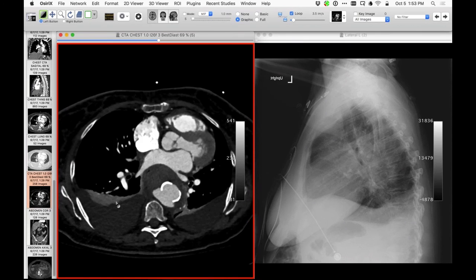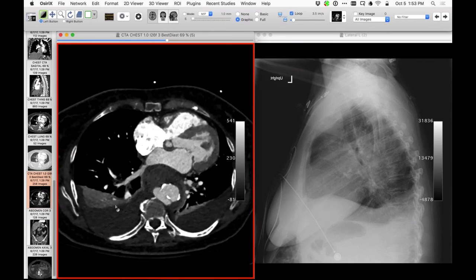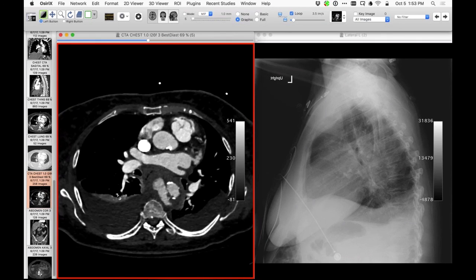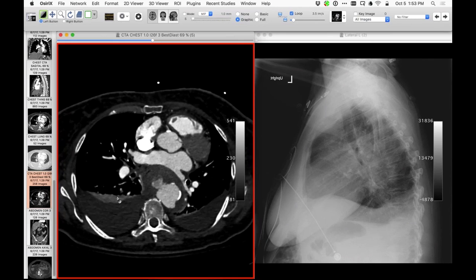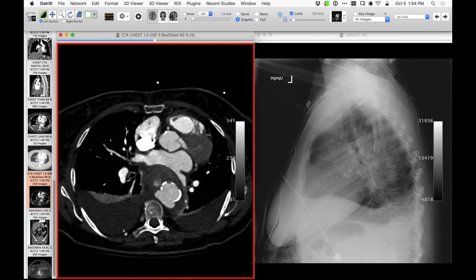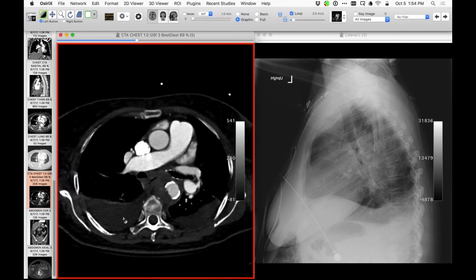It's really impressive. I was expecting this was going to be lymphoma or something like that with all that stuff, all that lymphadenopathy, what looked like lymphadenopathy, but I've never seen aortic pathology extend in like that. It almost looks as if it's getting in front of the airway too. It's definitely below the airway on lateral view.